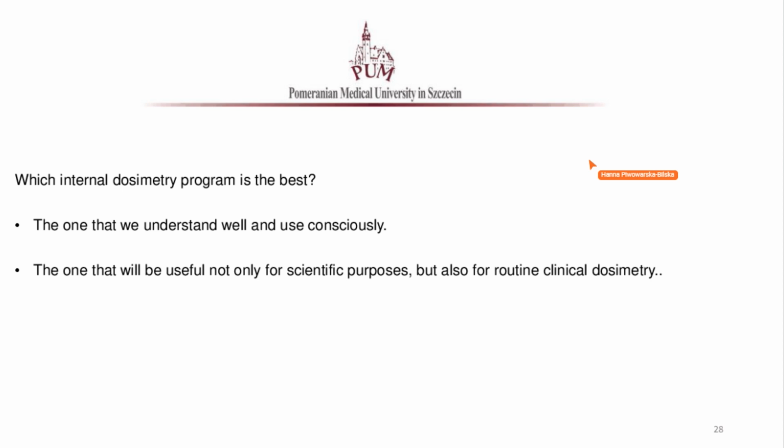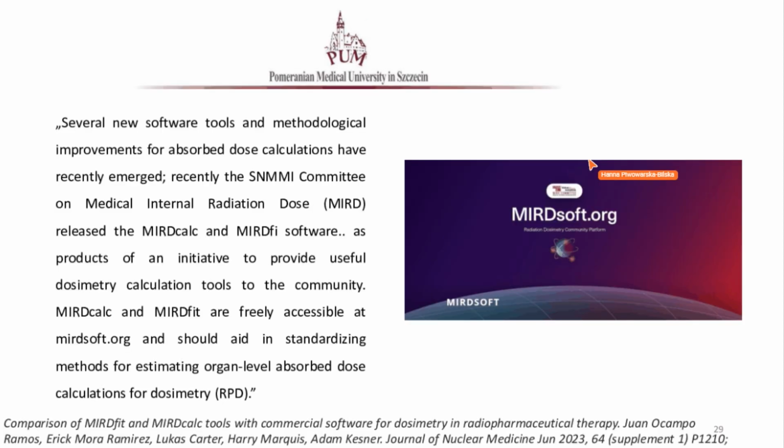On one screen, you can actually see several windows you have to calculate, for example, 8 windows. So it's hard to expect that the physician will sit down and perform dosimetry as a routine. Good softwares are the softwares that are friendly and easy to use.